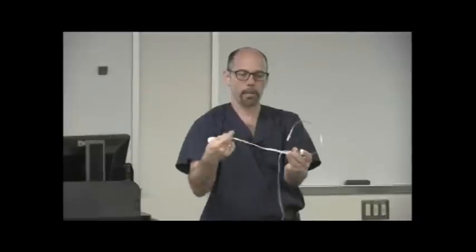What I want you to notice about a transducer is that this is the back, where the cable comes off, this is what I would call the back side of the transducer, what goes to my bag of fluid. This tubing is very soft and pliable, just like regular IV tubing. It is regular IV tubing. But from the transducer forward to what I hook up to the patient is a very different kind of tubing.